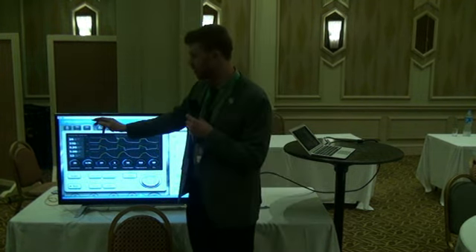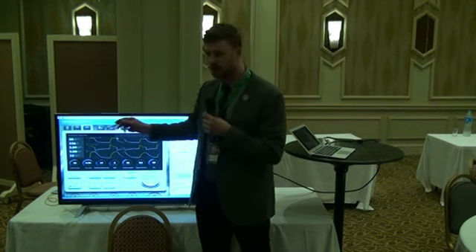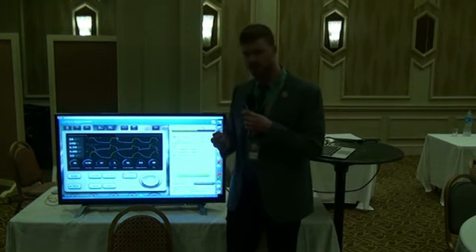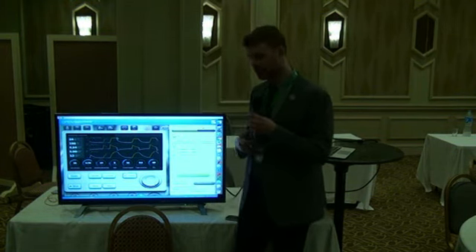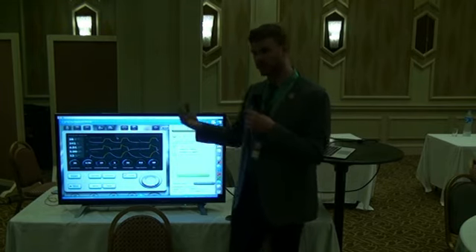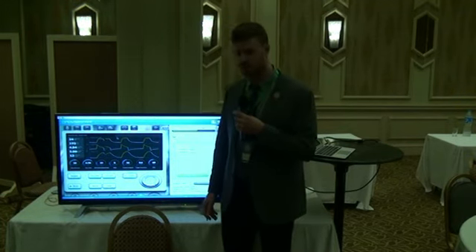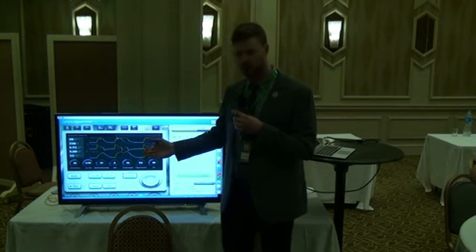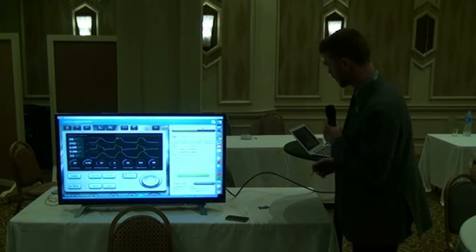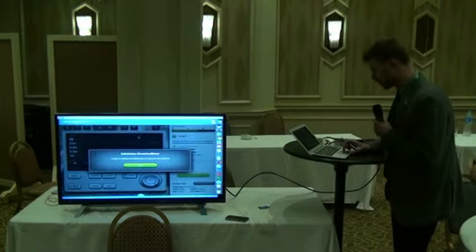What I would do is note that number, decrease the respiratory rate, and then watch carefully what happens to that 150. If it starts to go up, well, I've just improved my alveolar ventilation and given more time for exhalation, and the gas at the end of the breath contains more CO2 than the beginning of the breath, so I've done a net benefit for my patient if it went up to like 160, 170. If it did the opposite and came down to like 140, 130 or something like that, then I would just go back to what I was doing and figure out some other strategy. Okay, that makes sense, right? We might as well give bronchodilator, although I don't think we have a cool animation.